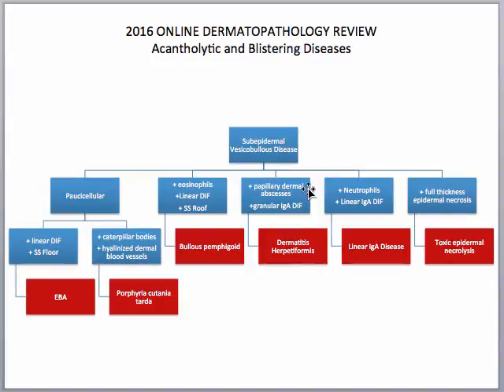If you have a subepidermal split with papillary dermal abscesses and granular IgA localizing to the papillary dermis on DIF, you would want to think of dermatitis herpetiformis. If you have a subepidermal cleft with neutrophils — which may or may not be solely in papillary dermal abscesses — and a linear IgA pattern on direct immunofluorescence, you would want to think of linear IgA disease.